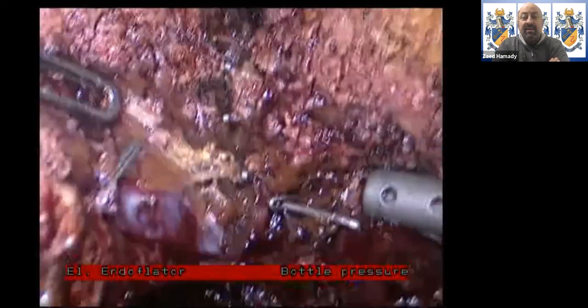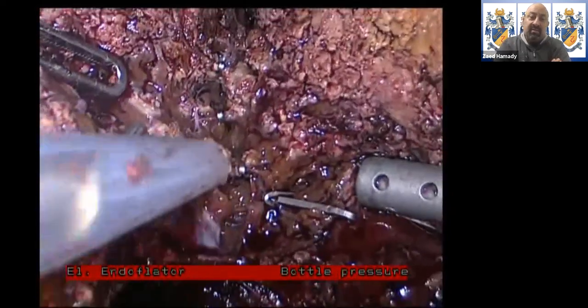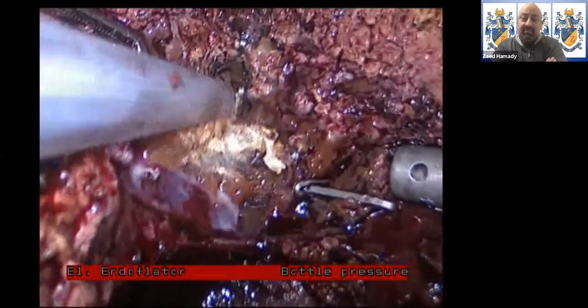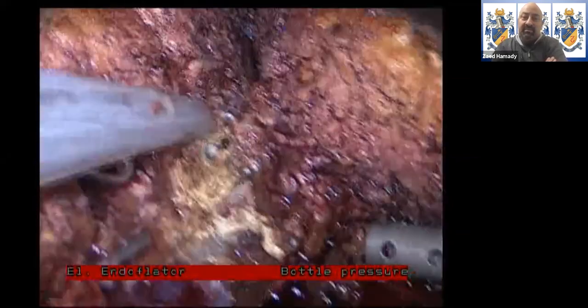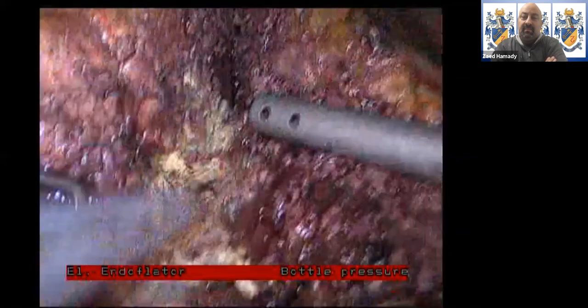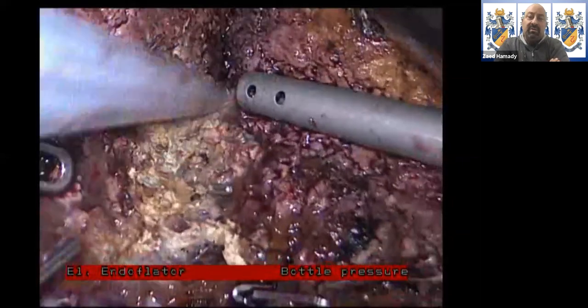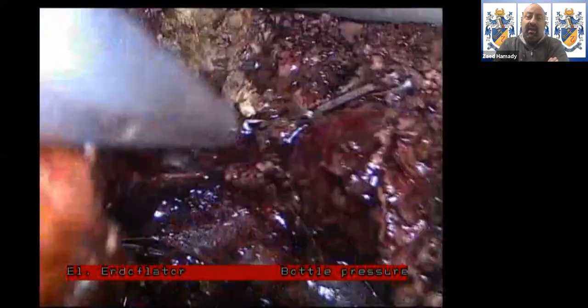This is under Pringles, so don't be surprised that there is no blood loss. So at the moment, there is Pringles going on. Usually, you get a little bit more bleeding when you don't use the Pringle. The setting of the CUSA, as you may know, I usually put it on the 2+ setting, and the diathermy, usually I put it on 70 spray.